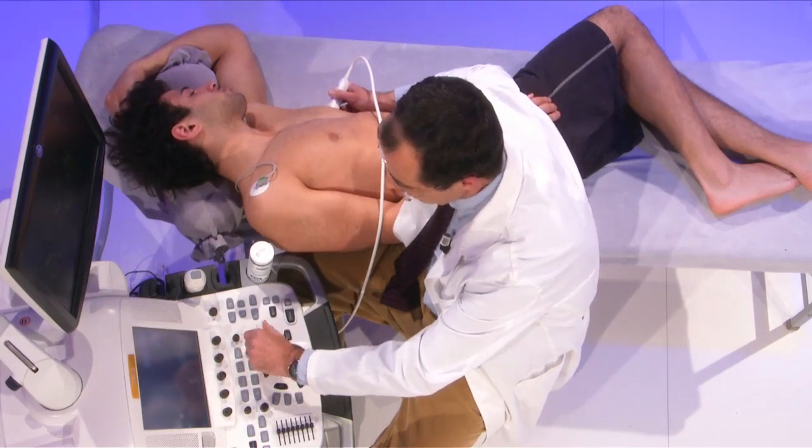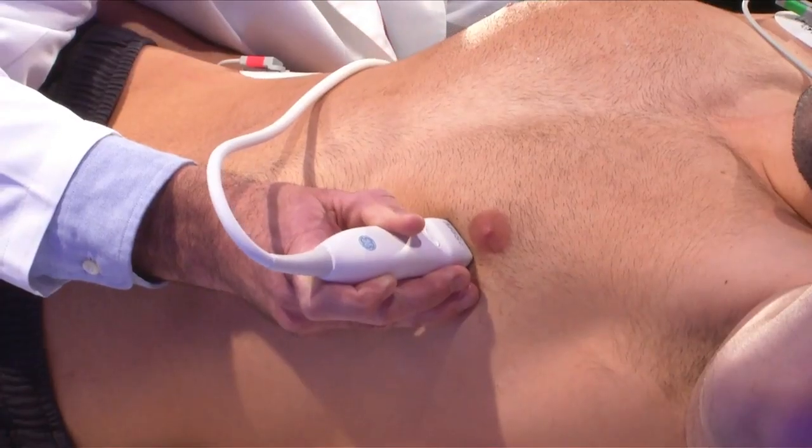The other parameter pointing to this is the presence of pulmonary hypertension. Now we change to the right heart.